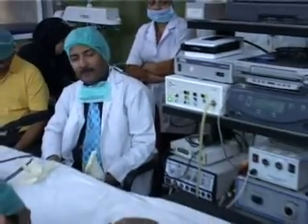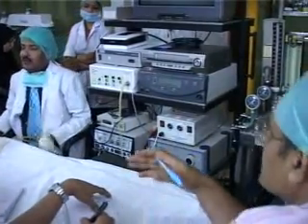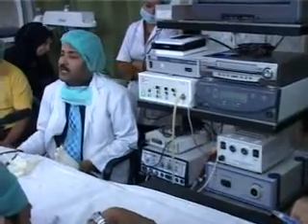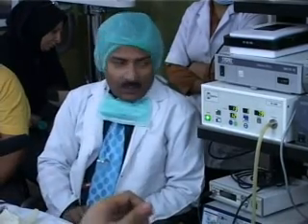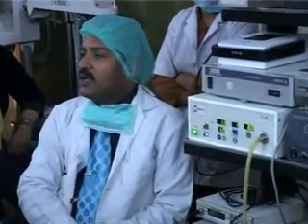Having a leak of 40 liters at maximum capacity, doesn't it affect the team? The question is that if there is a leak of 40 liter per minute, does it affect the surgical team? The answer is no. Why? I will tell you that carbon dioxide is not a poisonous gas.